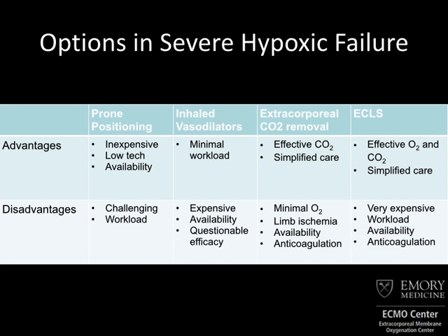So that is essentially ECMO for cardiogenic shock. For respiratory support, it's a different situation. I know that you're probably disappointed that I wasn't able to show you a bunch of randomized controlled trials and things like that. And unfortunately, that's cardiac surgery, right? ARDS is a different ballgame. And I think there's an understanding out there that we need to study this technology, and it's being run now much more by medicine people than surgeons. And those folks are focusing on really how should we use this technology.